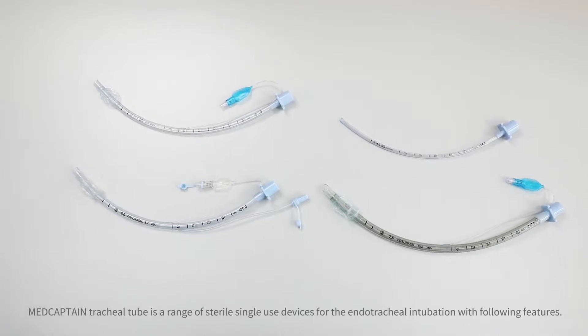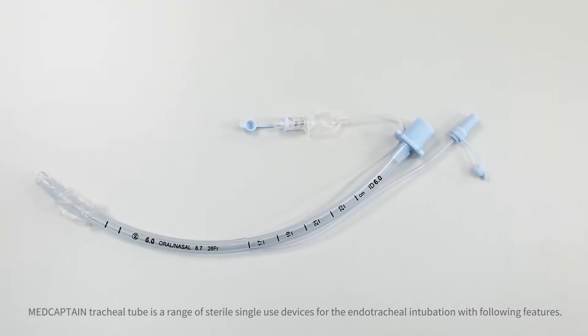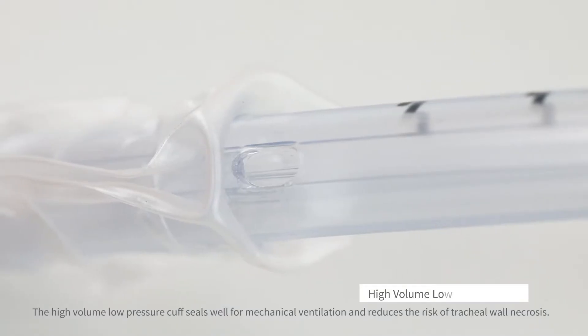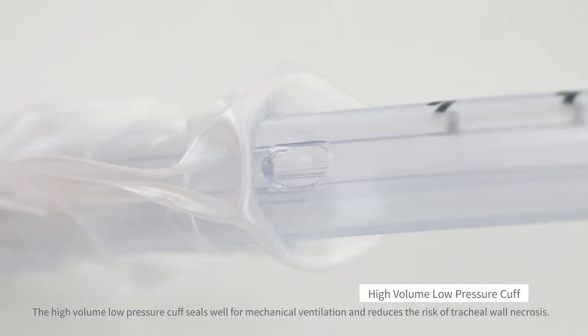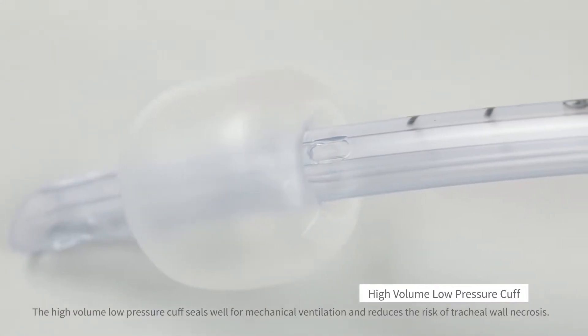MedCaptain Tracheal Tube is a range of sterile single-use devices for endotracheal intubation. The high-volume, low-pressure cuff seals well for mechanical ventilation and reduces the risk of tracheal wall necrosis.